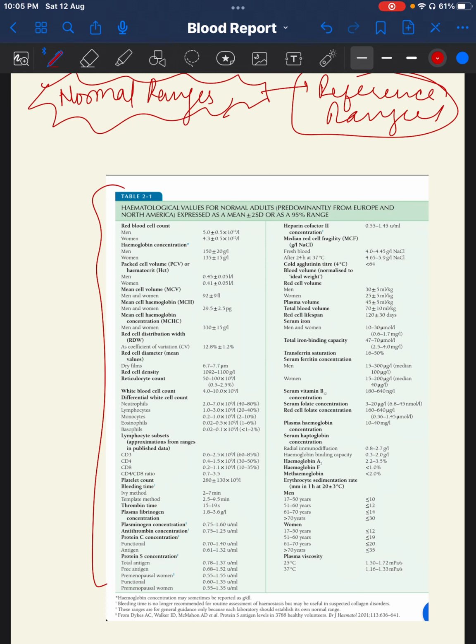Yes, there are variations depending upon the ethnicity of that area. We do have some variation, but there is some set pattern from where we should know this is the set limit, and it can vary from this limit by 1 to 2%. That's fine. So I need to know what that set limit is. This set limit is the international guidelines.